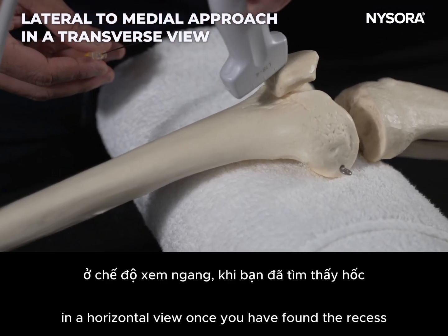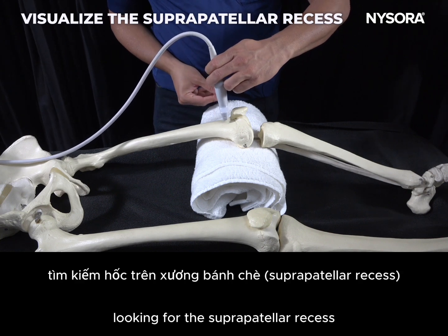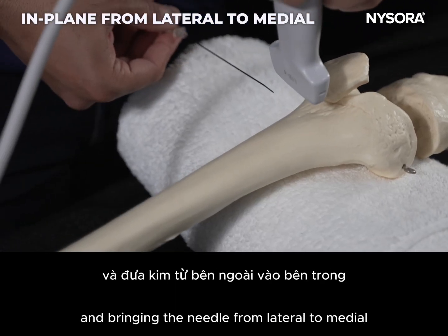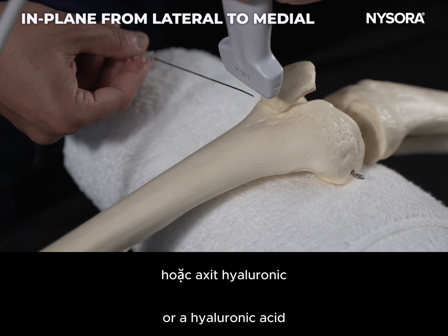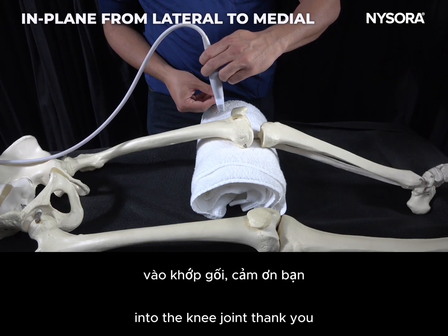Once you have found the recess, you will turn the ultrasound probe horizontally looking for the suprapatellar recess and bring the needle from lateral to medial in plane, injecting the local anesthetic steroid mixture or a hyaluronic acid or a platelet rich plasma injection into the knee joint.